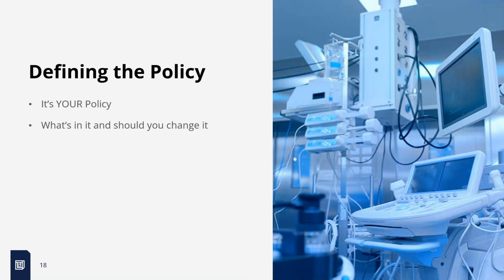So let's talk a little bit about the policy behind what you're doing. And again, it's your policy. It's not your personal policy, but your hospital's policy, and what was defined prior to you coming, what you might have the authority to define or help redefine. If you are Joint Commission, make sure that if you or somebody in your organization hasn't looked at your policy since the changes, you're not referring to specific old code language. They don't like that. If you have specific call outs to the old code language in your policy, you probably need to update that policy.